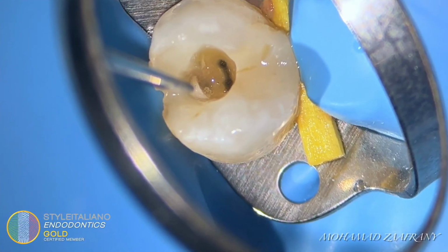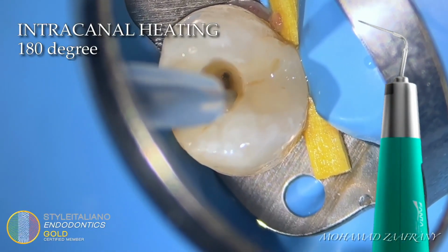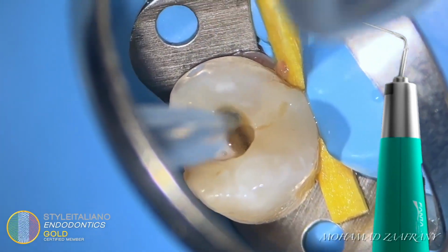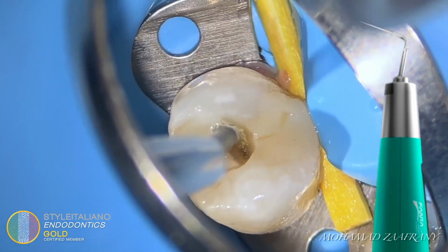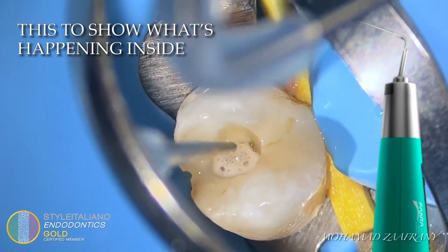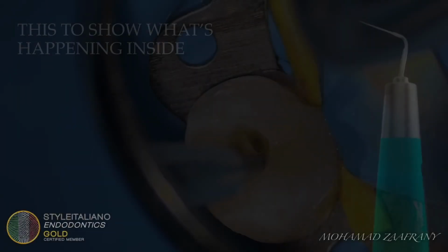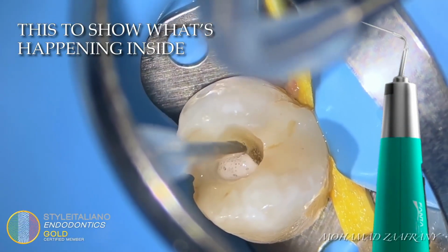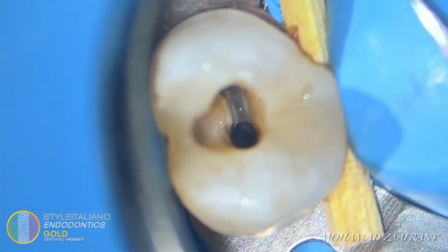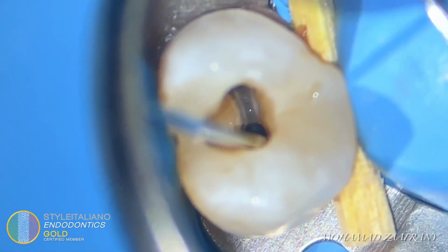After proper access and shaping, this is the way I'm doing intracanal heating of irrigation. Adjusting the temperature to 180 degrees on the E-heater with intermittent periods of cooling. Here you can see evaporation of hypochlorite, and also the surface tension of the liquid decreases, resulting in better penetration of irrigation into narrow areas. After proper cleaning and final flush protocol, now it's the obturation step.